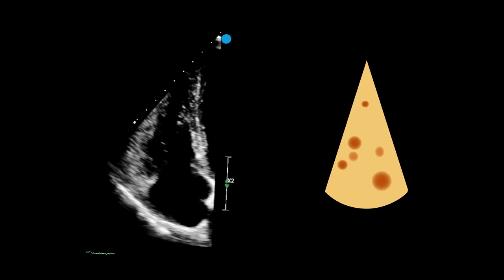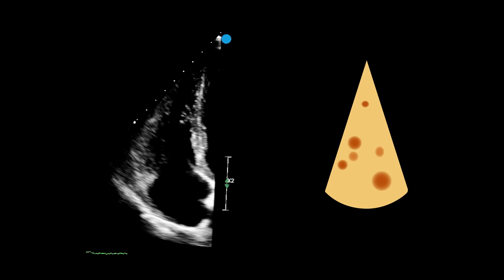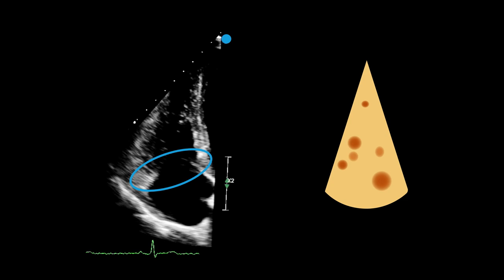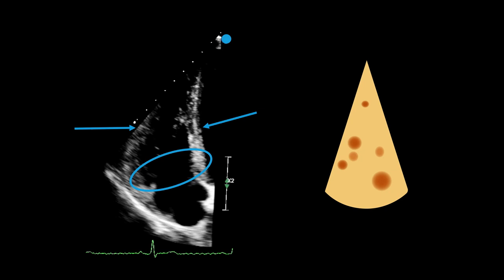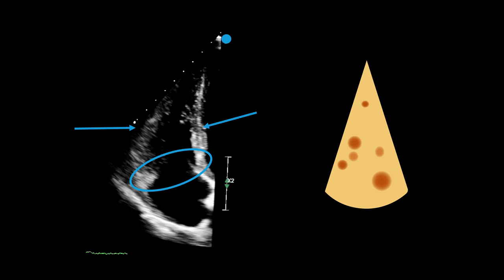Up until this point, we have discussed the normal right heart. In review, the size and shape of the right ventricle should be triangular, like a wedge of cheese, as seen here. The tricuspid annulus, where the tricuspid valve sits securely, should move up towards the apex during systole and move back down during diastole. The free wall of the ventricle should contract towards the interventricular septum during systole, making the chamber of the right ventricle smallest at the end of systole, and then move away from the septum during diastole, making the chamber largest at the end of diastole.